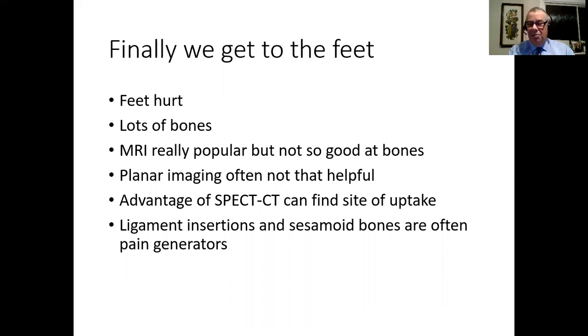But the problem is our feet aren't the world's best designed for that. So having carried the weight of people's bodies for their whole life, feet often hurt. The other thing is, if you remember anything about looking at feet, there's lots of bones. So a bit like the hand, it's quite difficult to localize.